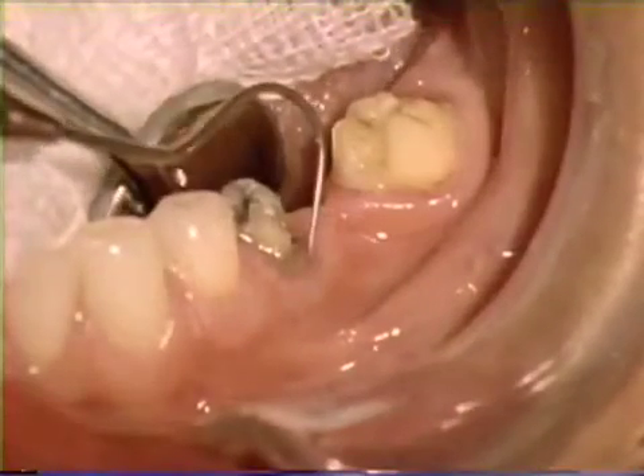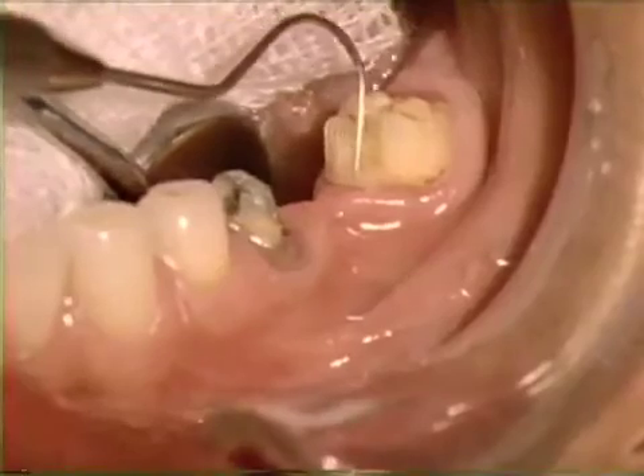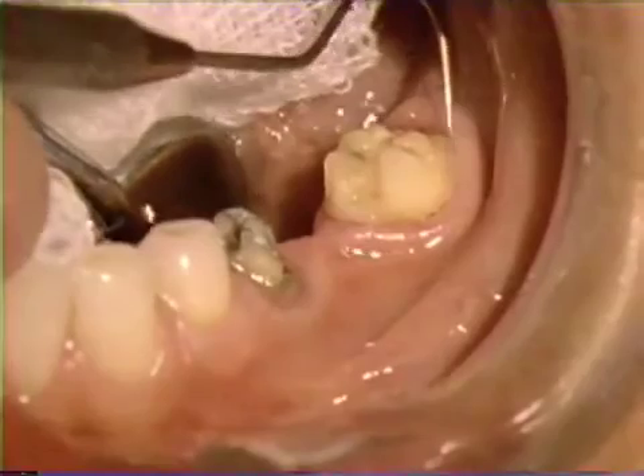The treated area is shown 25 days after surgery. Although healing is not quite complete, the recontoured tissue is healing in a normal and expected fashion.